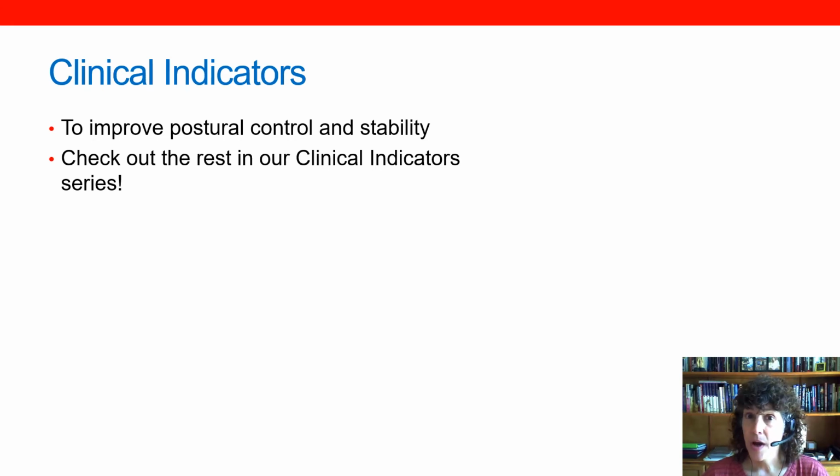So it is possible to use dynamic seating for the goal of increasing postural control and stability. This is probably the most recent clinical application to hit our radar and perhaps one of the least common applications, but it is an evidence-based application. For more information about other clinical applications, check out those videos in this series.